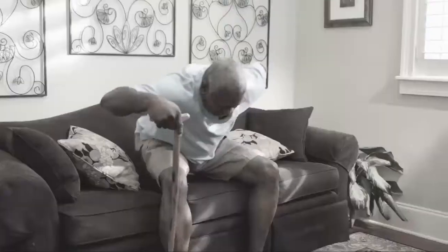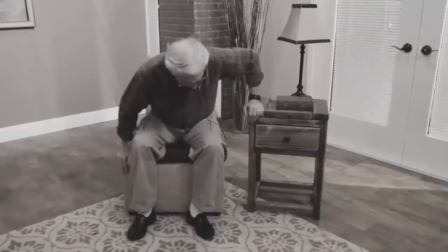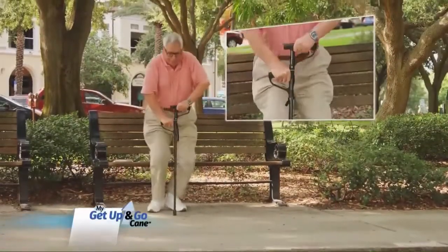Standing up from a sitting position can be a real challenge, and reaching out for unsteady objects can be dangerous. Well, not anymore. Now there's My Get Up and Go Cane.